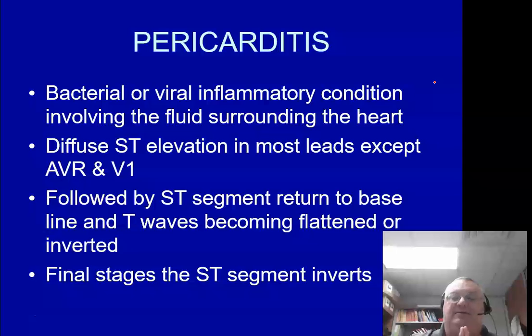And the final stage is actually the ST segment will invert, all right? ST segments return to the baseline and the T waves become flattened or they invert, okay? Last but not least on this, it's going to be massive elevations along with a flipping T wave. Pericarditis, I'm telling you right now, you're going to look at it and go, oh, yeah, pericarditis, definitely. So 9 or more leads, guys, it's more than likely pericarditis, all right?